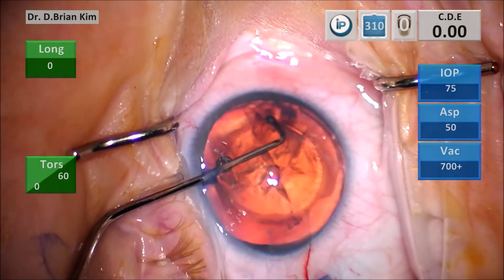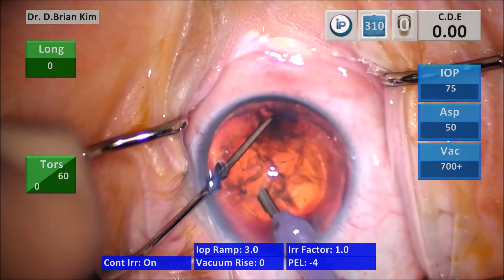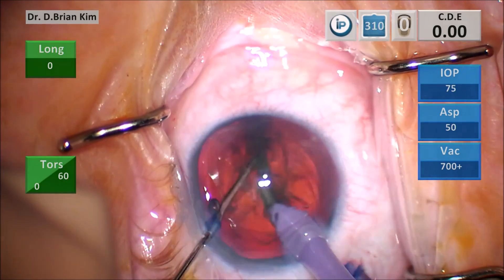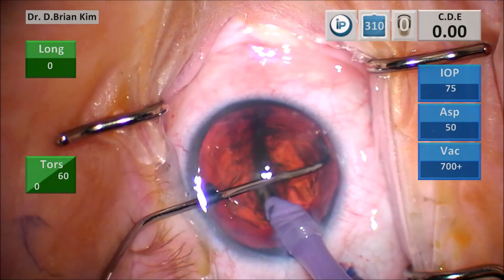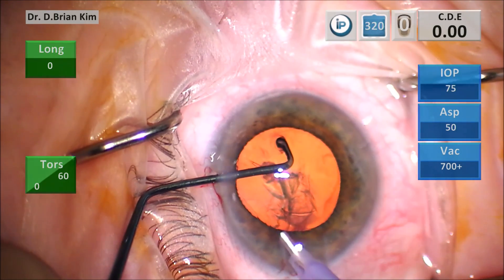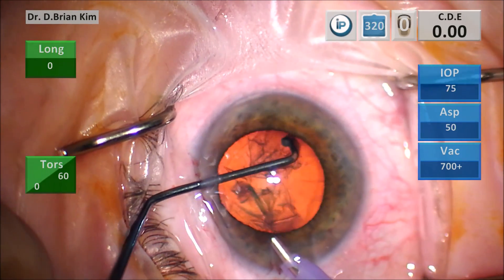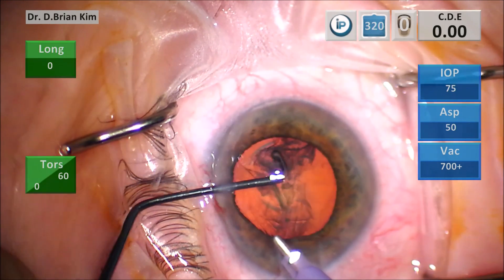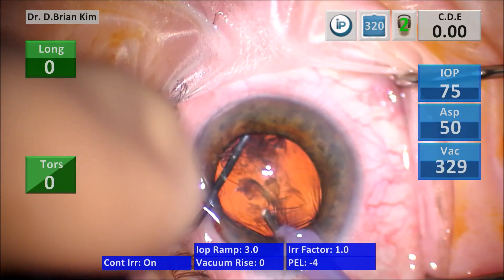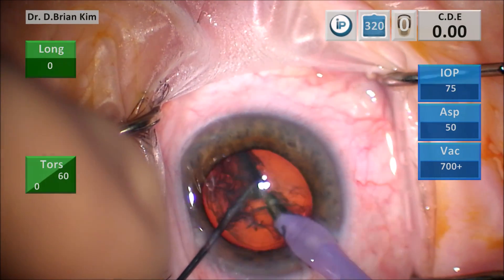I'm pronating and supinating just to show how easy and fluid the movements are. I pronated to get under the anterior capsule out to the equator, supinated my hand for the ready position. The chopper is sub-incisional, doing the same thing — they meet in the middle and fracture the endonucleus in half. The pronation and supination move is the same for the cross chop.